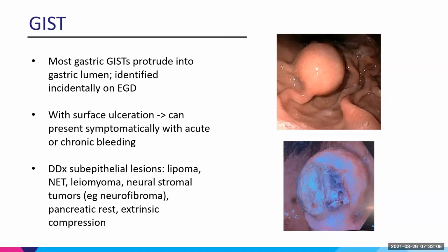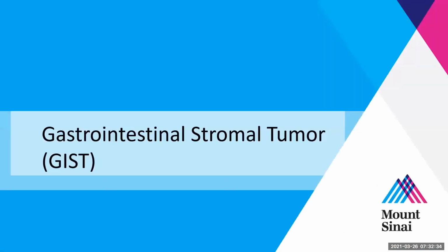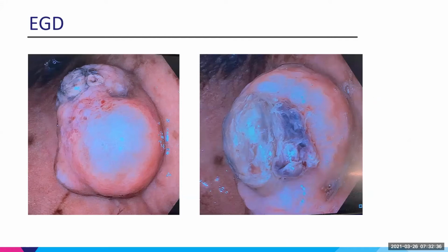Hi, Steve, Nikhil here. So Christina's smiling because I remember we did this case at like 4 in the morning, and the patient had a pretty massive hemoglobin drop. And as you alluded to, as soon as we saw this, we knew it was a GIST. And so I think it's very surgeon specific to really get the correct treatment of choice, which in this case was an easy enough wedge. And so I called the surgeon specifically to make sure that we could bypass getting a tissue diagnosis, because this was not concerning at all for a gastric adenocarcinoma.